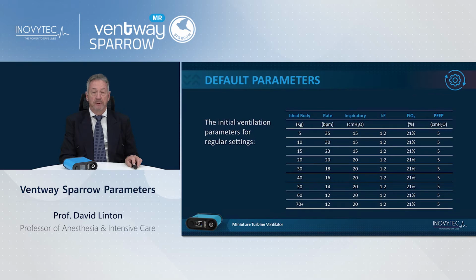Secondly, it also gives you, and you can see the change of the tidal volume to the inspiratory pressure in centimeters, the pressure that is allowed during inspiration for the initial ventilatory parameters set by default.